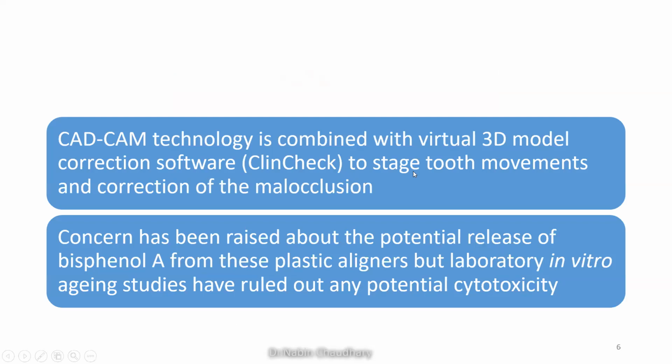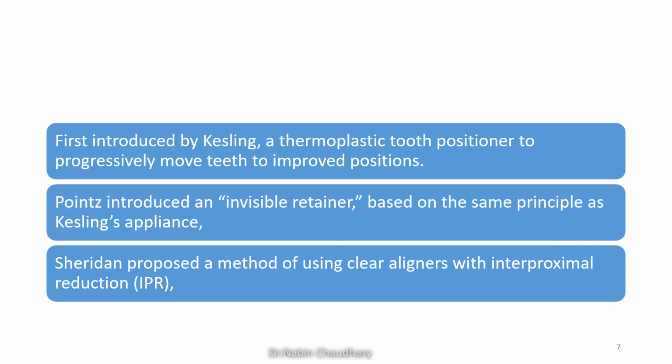CAD/CAM technology is combined with virtual 3D model correction software to stage the tooth movements, which is used for the correction of the malocclusion. Also, concern about the clear aligners has been raised because of the release of bisphenol A from the plastic aligners. However, in laboratory in vitro studies, no potential cytotoxicity has been observed from this release of bisphenol A.